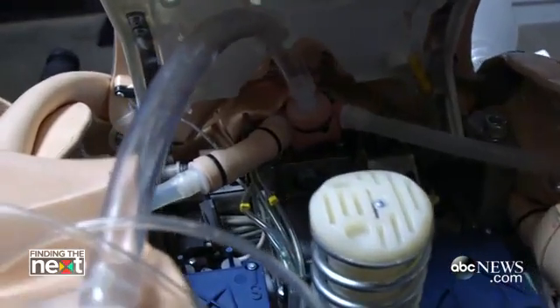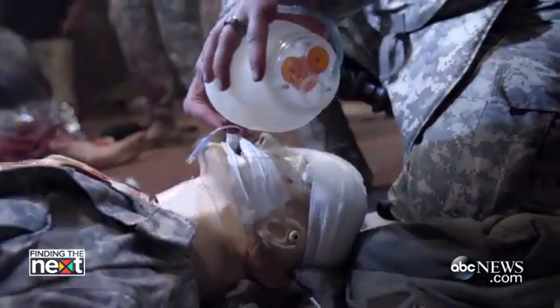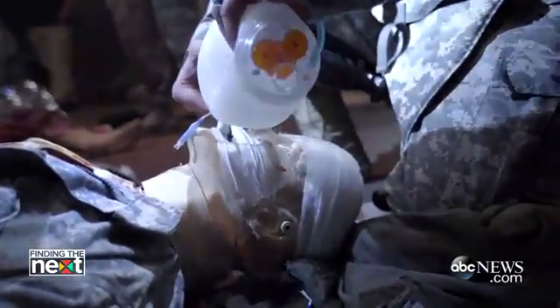We can occlude airways — we can constrict the trachea, or have the mannequin's tongue fall back. You can insert an ET tube or a King LT into the mouth of the patient.